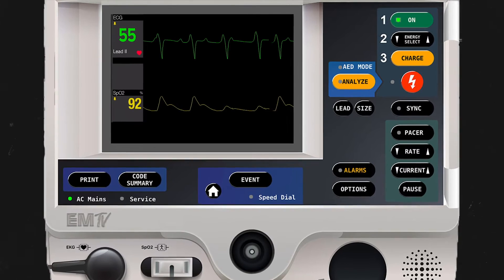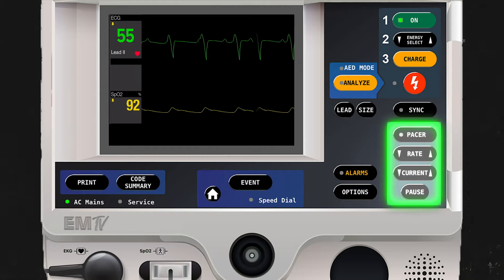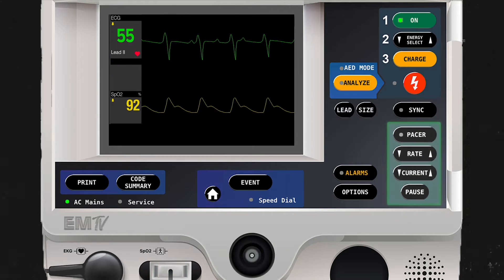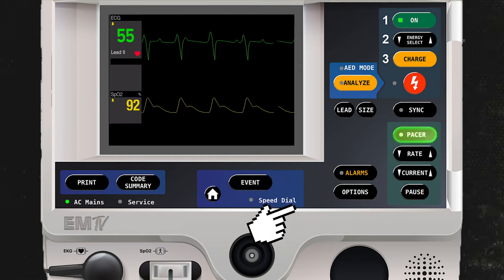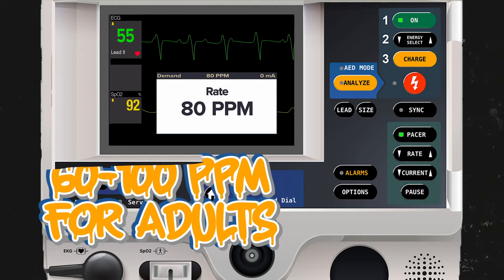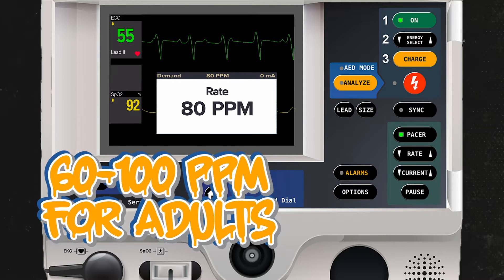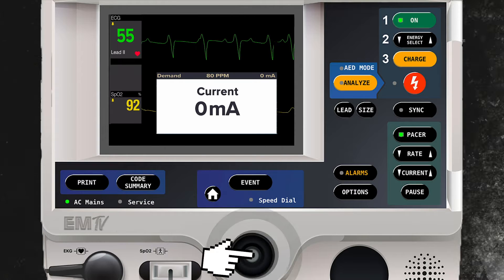Unlike synchronized cardioversion and defibrillation, all of the pacing functions are present in this green box. After activating the pacer function, the first pop-up window will prompt me to enter a rate at which pacing will occur. I'll use the jog wheel to raise this rate to 80 pulses per minute. You should choose a pacing rate that is within normal limits for this patient's age. I'll press the jog wheel to move to the next screen.